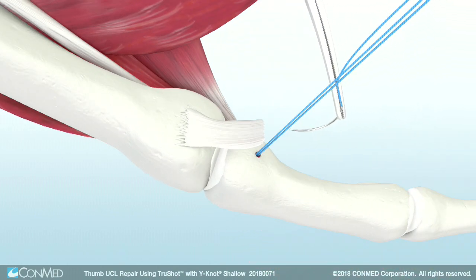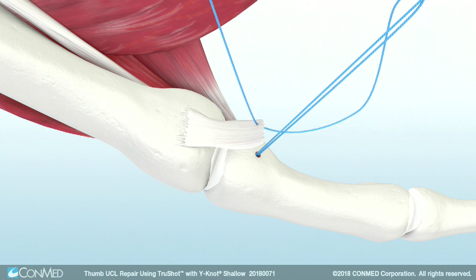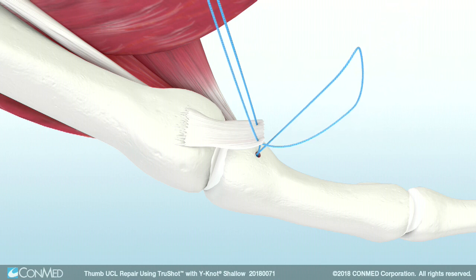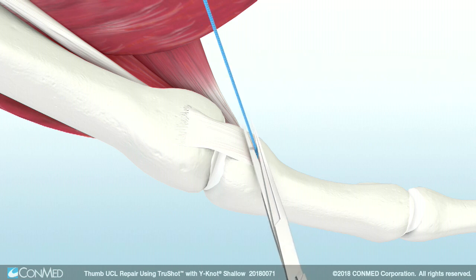Use the attached needles to pass both suture limbs through the ruptured ligament. Once passed, cut the needles from the suture ends and use overhand knots to tie the suture ends together and fixate the ligament to the bone. When fixation is achieved, cut the suture limbs.